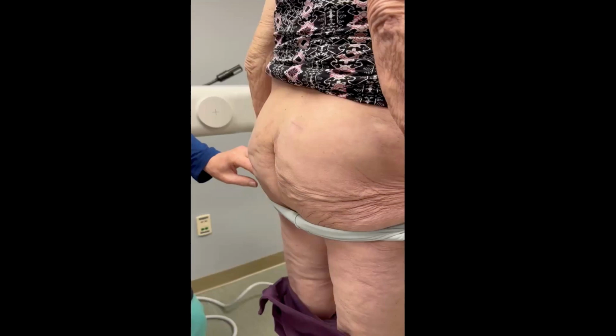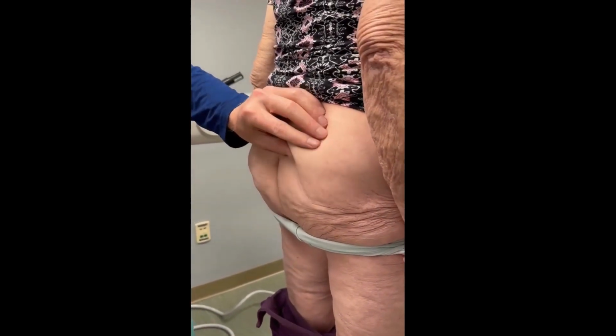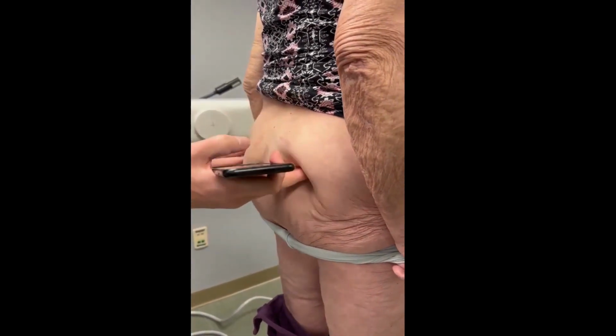Here within the first video, you can see the demonstrated mobility of her battery with manipulation and in activities like getting dressed. "Do it slow, but as it gets around here, you kind of feel this is where the battery is. We're just trying to have it pulled tight because I think it moves the battery. Okay. So it kind of has it pulling up on the tissue there. All right, so you can go ahead."